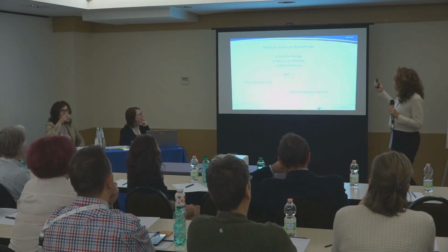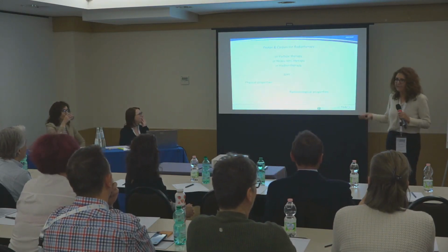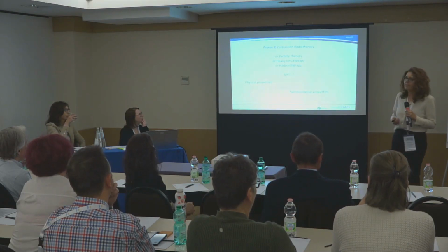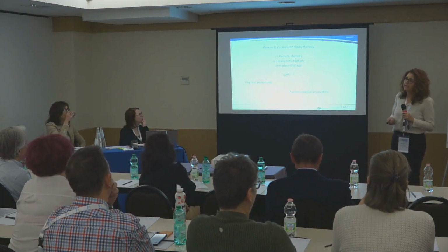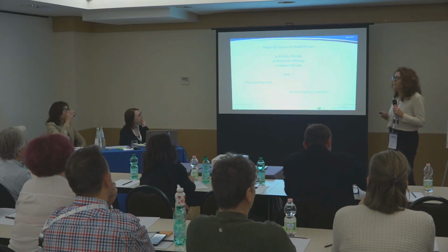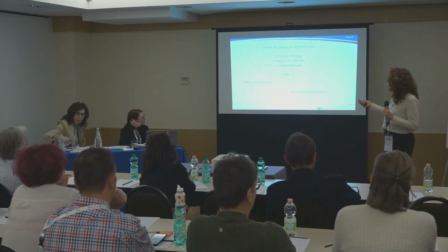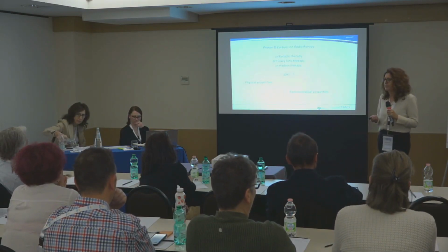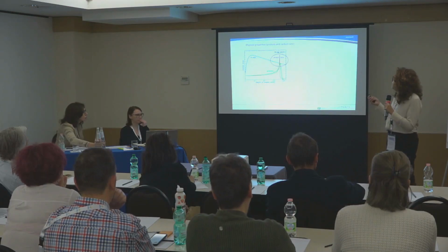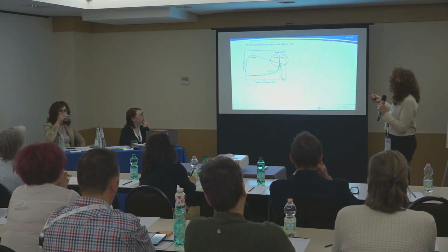Okay, so proton and carbon ions, also called particle or heavy ion or hadron therapy, have aroused a very great interest in clinical application in the last decades, thanks to their physical and radiobiological properties. What about physical properties? The physical properties are common to protons and carbon ions.